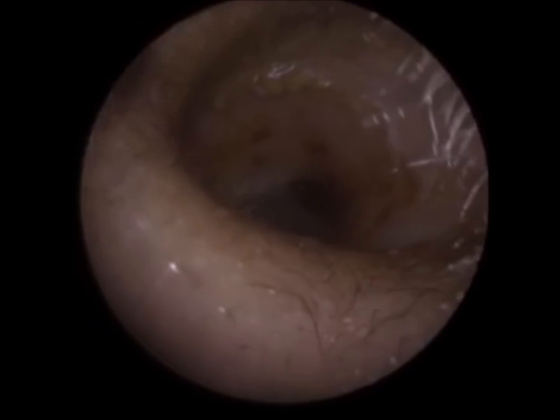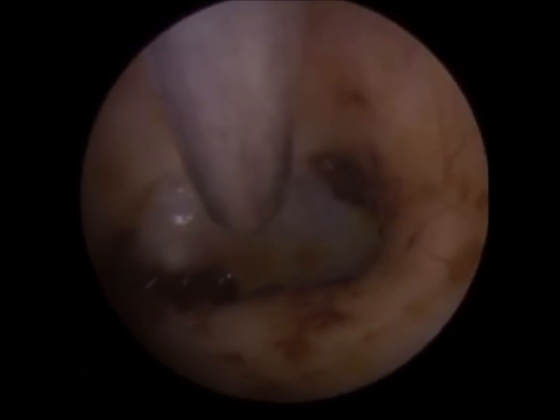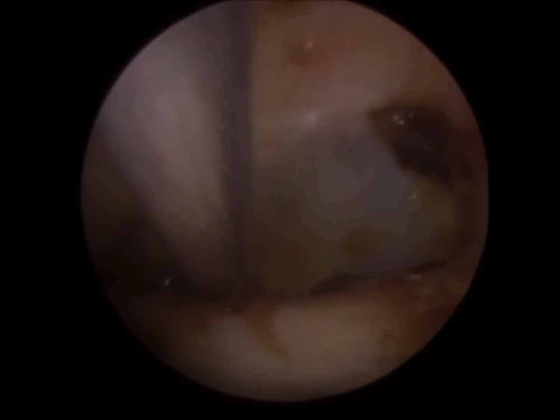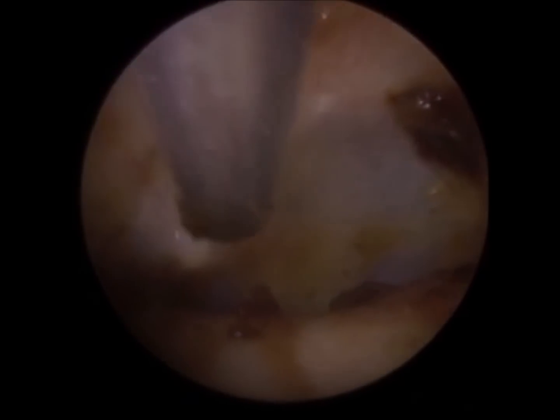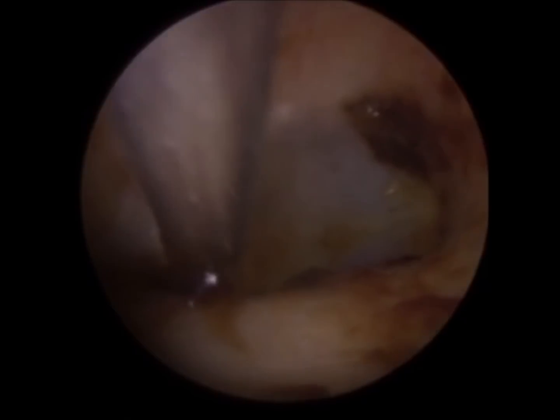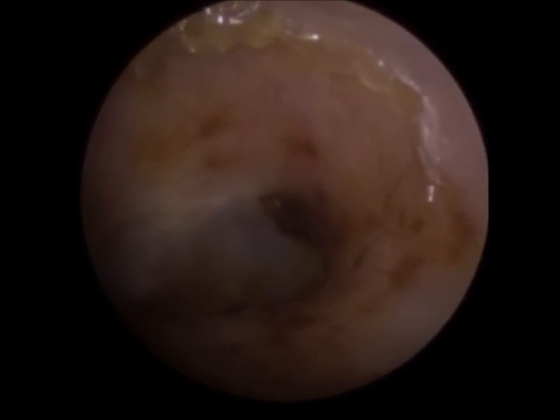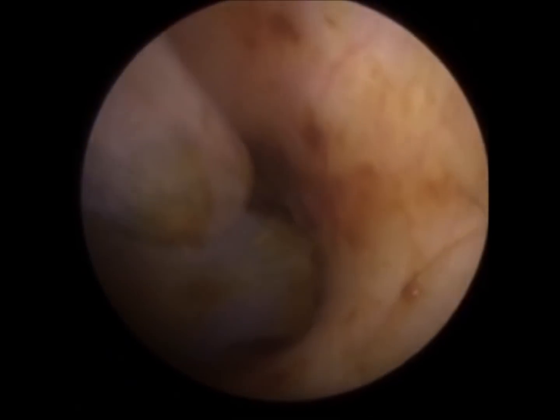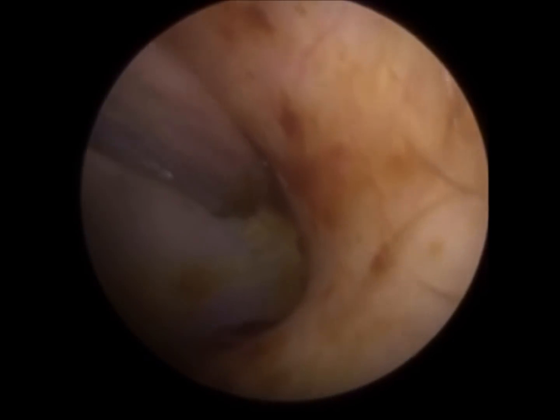Clinically, this wax is not going to cause the patient any issues, but there's a bit of wax just at the posterior and anterior edges of the eardrum, so I've gone in with a fine end suction gauge just to remove that. Quite often in the videos people leave comments highlighting that there's a bit of wax left over, but a bit of wax is good. I explained the reasons for that in my previous video, and I suspect a lot of the people watching the videos have got some wax in their ears, but unknowingly.